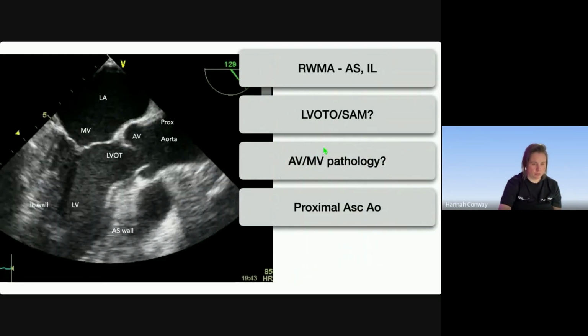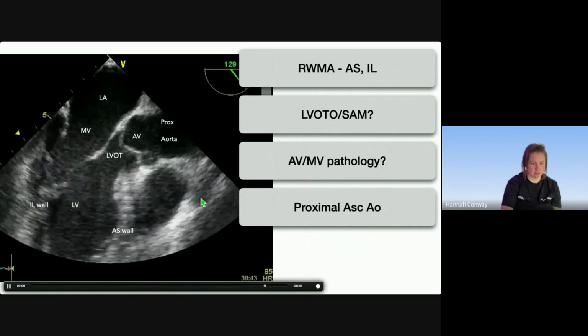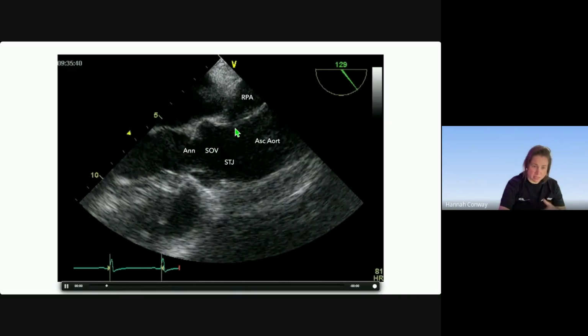You've got a little view here of the right ventricle, but it's obviously only a slight section of it, so we can't really comment too much. If we were to pull the probe back slightly and reduce the angle ever so minimally, we will be able to see a really good view of the ascending aorta rather than just the proximal root. We want a good long axis of the aorta, and the benefit here is that we can now measure all of those aortic dimensions.